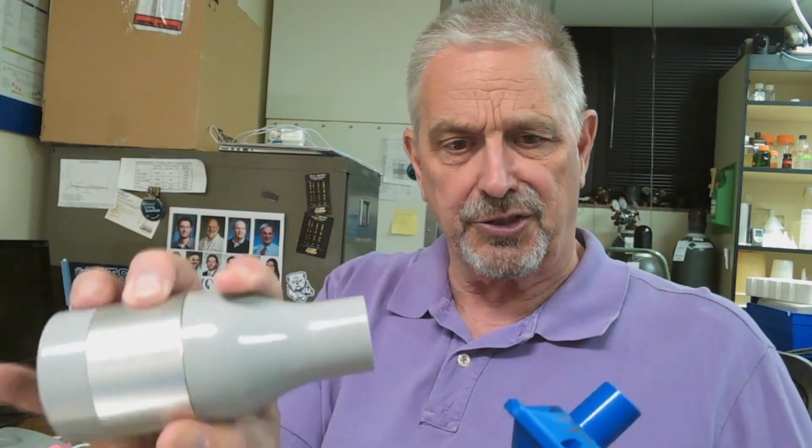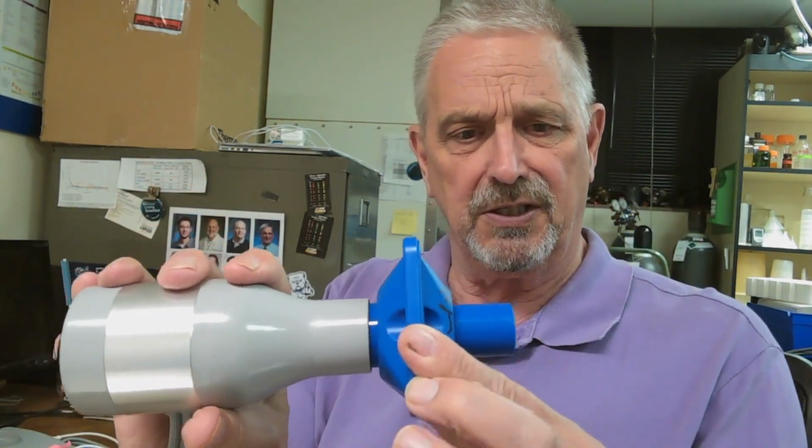Before we look at the maneuver itself, you're going to need a nose clip. You're going to need your own sterile mouthpiece, which you will be inserting into the pneumotach with the fat end going into the portion of the mouthpiece. And then you'll be blowing into this, but only after you put a nose clip on.